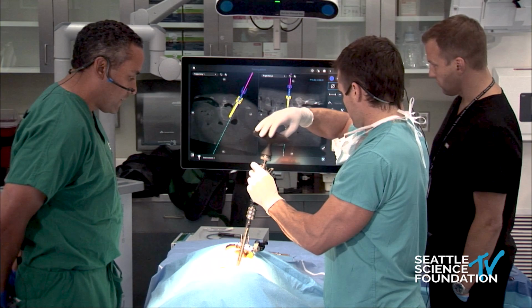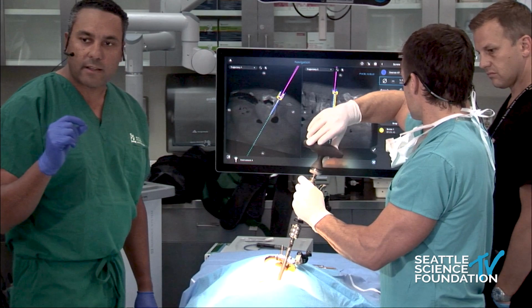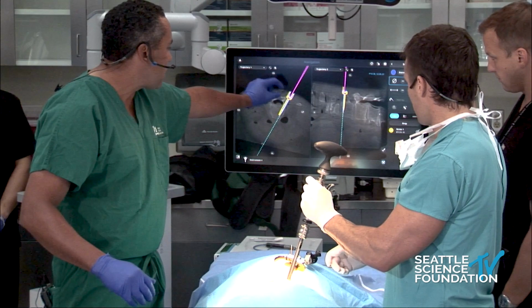And David, you did not tap, is that correct? We didn't tap. So if I had a different system that had the integrated K-wire, you can do it that way. You're good. See how your tulip's lined up? You could maybe put it in another, and that's it.